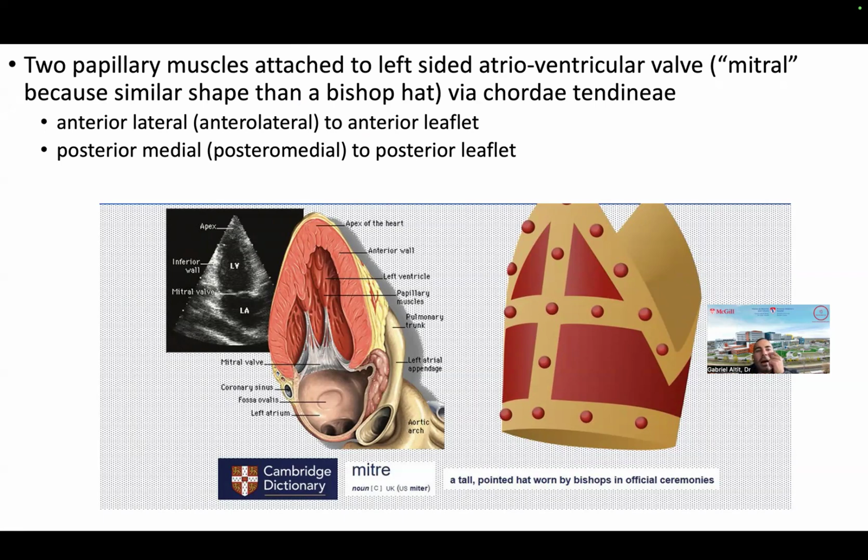Okay, perfect. And so the mitral valve typically has two papillary muscles. And generally you have the anterolateral, which connects to the anterior leaflet, and you have what we call the posteromedial, which will connect to the posterior leaflet.